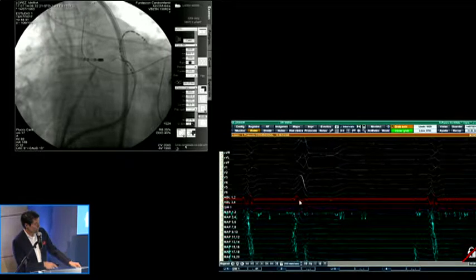Well, the question we have to ask ourselves is whether we will remove the whole system so that we can place the ablation catheter in this area through the Agilis and do ablation from the catheter, because this is the earliest area. But there is a question for you. No, but what I wanted to say is, versus giving an injection. What concerns me about the injection is that we are not early in that area.